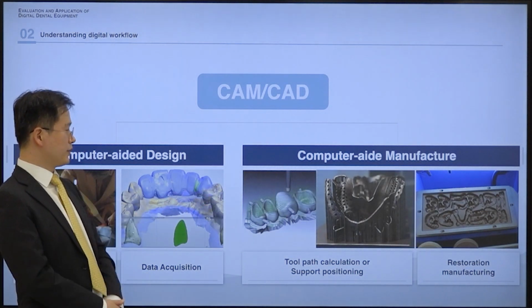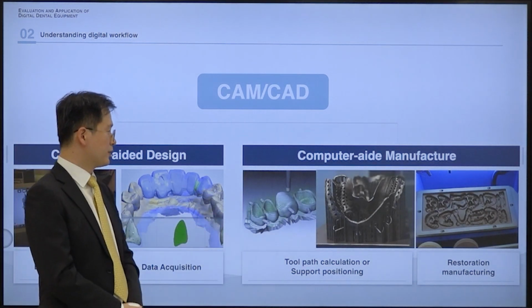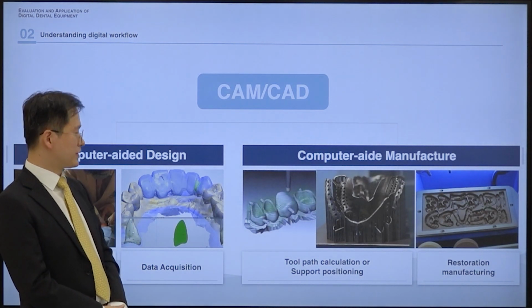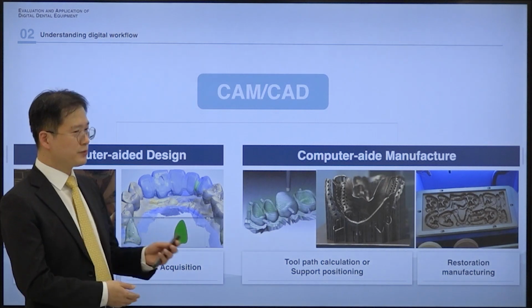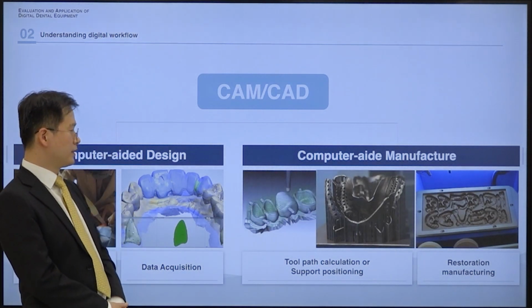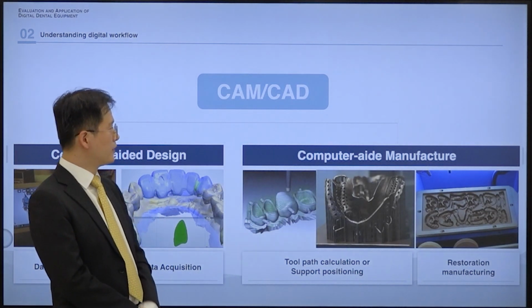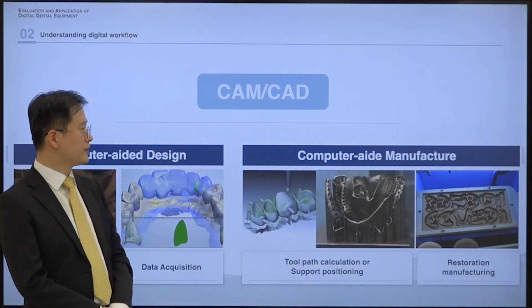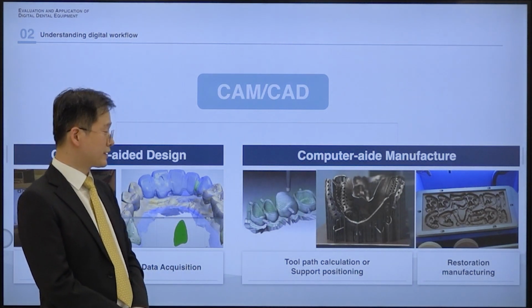In the CAM aspect, you have to understand toolpath calculation and support generation. We have to use CAM software to operate a milling machine or 3D printers. After that, we can get a restoration that we can use in daily clinic.